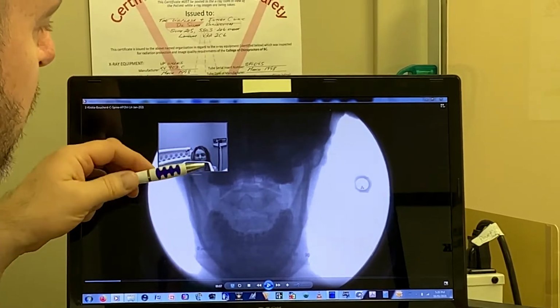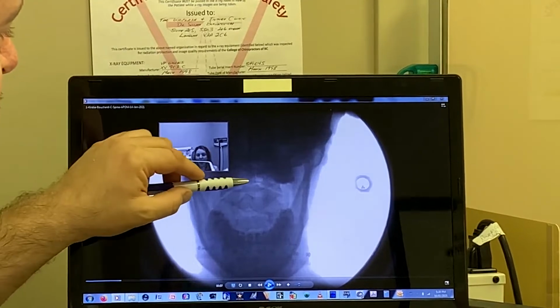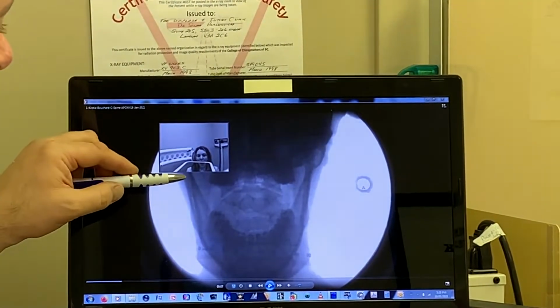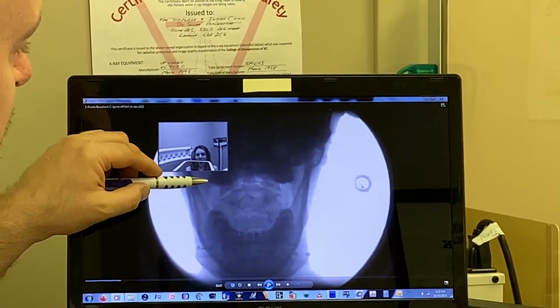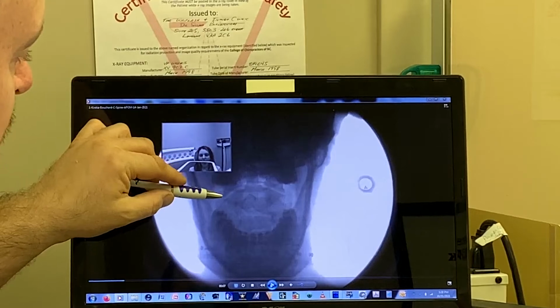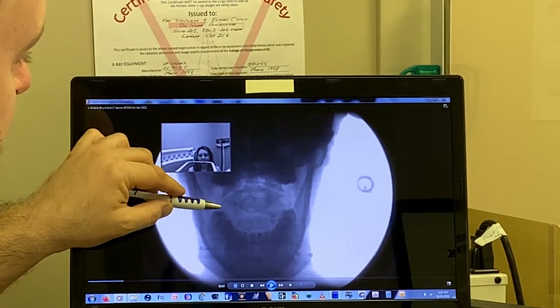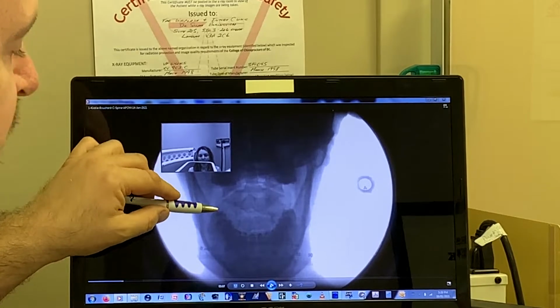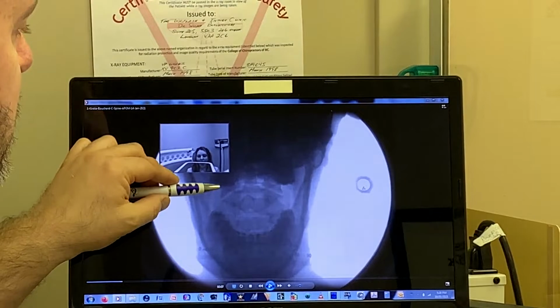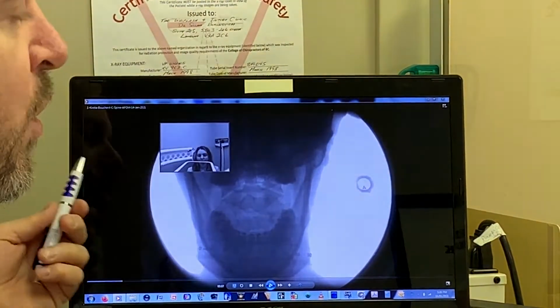And so when we're evaluating the movement, as you do the movement in a second here, I'm assessing to see if these spaces remain equally spaced. They should stay relatively equally spaced. And the additional thing that I look at on either side when you go to the left and to the right is that this side margin here of that block on the first bone and the side margin underneath that of the second bone stay lined up vertically. As you go side to side, there should be no sliding of this margin to the side relative to the one below it, so no overhang.